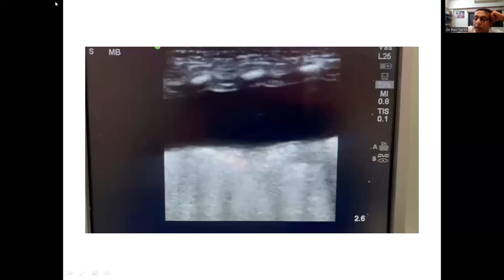So normally what I do is I would do exactly the standard protocol of having R1, R2, R3, R4. I would do all my longitudinal scans. And as you come lower down, depending on how much fluid there is, I would say R3, R4, it's usually the R4 and the L4 regions where you'll get the collapsed lung with what is generally called the jellyfish sign, because you can actually see the distal end of the lung. Here you're in the middle. My gut feeling is probably an anterior zone or a lateral zone, but higher up. So you can't actually see the jellyfish sign. But what you're classically seeing at this particular point is pleural fluid causing compressive atelectasis.